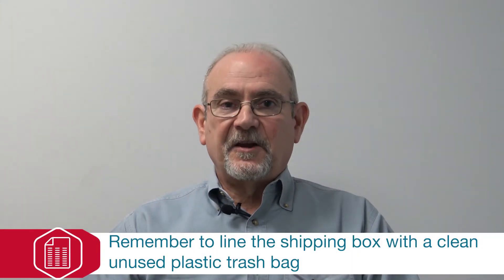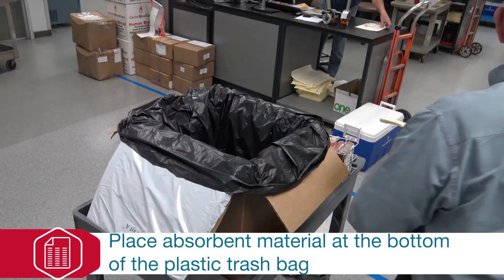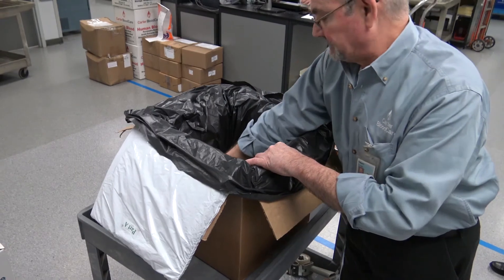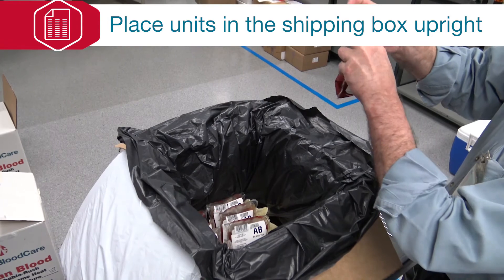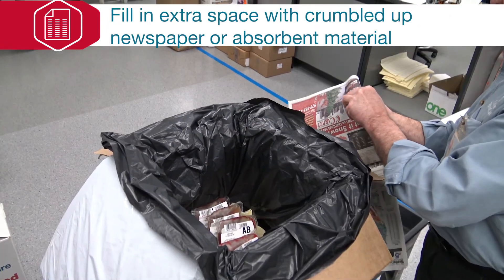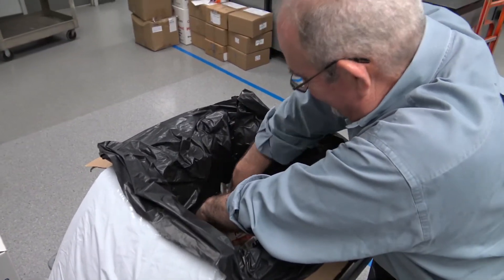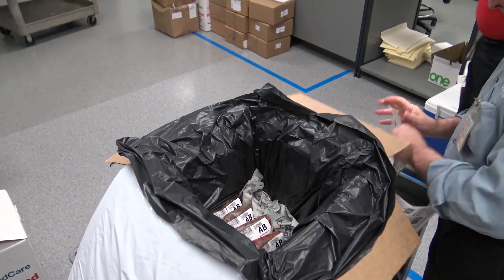Once the unit information is documented, you begin packing the units by first placing absorbent material at the bottom of the plastic bag that is in the shipping box. As you place the units in the shipping box, make sure that you place them in upright with the tops folded down. Any extra space after packing the units should be taken up with crumpled up newspaper or more absorbent material. We're using newspaper in our example.